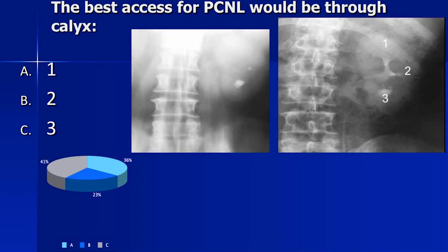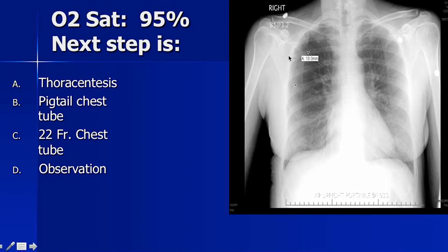So the next question would be managing complications. Often talks will focus on the therapy, but we don't talk enough about how do you recognize complications and how do you manage them. So you'll also hear a little later in my talk that I always go in the upper calyx, most commonly a supracostal approach. We'll discuss some of the outcomes we have with that.